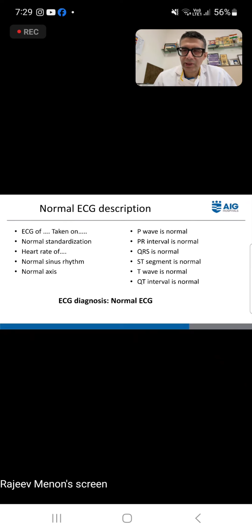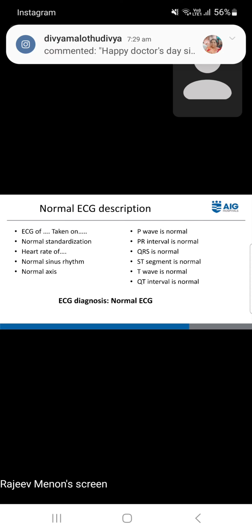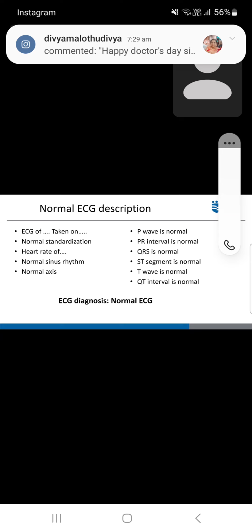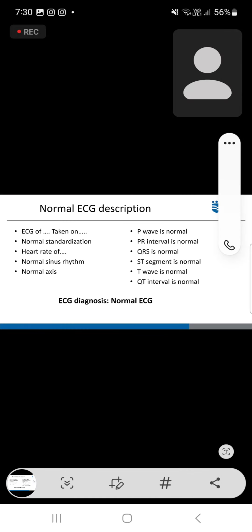Okay, so this rigor of going through each aspect of ECG is fundamental for you to learn ECG interpretation. If you don't go through this throughout your life, you will be in confusion. At the end of all that, the electrocardiographic diagnosis they must mention, and also try to add the clinical diagnosis that you reached. Then that concordance or discordance of anything, you will note, and again go back to read the electrocardiogram if there is anything unusual.